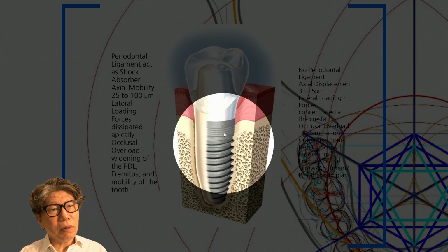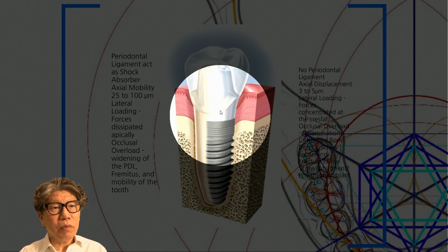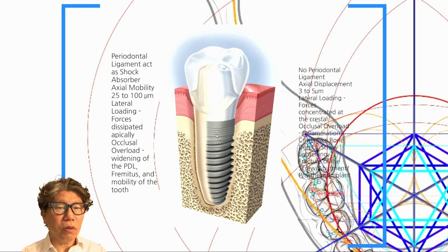Additionally, in the case of the United States, when a fixture breaks or tears, it seems to become an issue. Therefore, perhaps American products still have some 64 alloy left, and it seems that almost all European products are manufactured with pure titanium. Thus, it seems like implant fixtures are being manufactured with pure titanium.